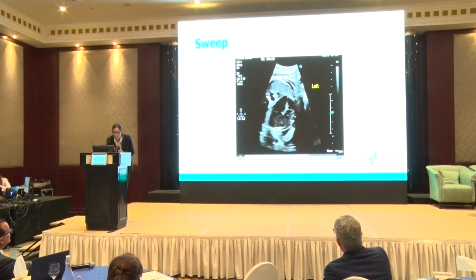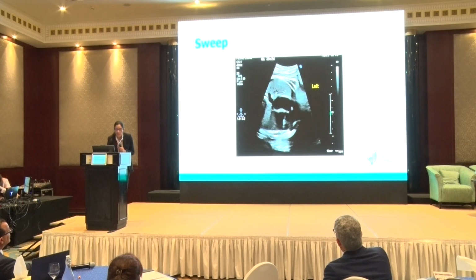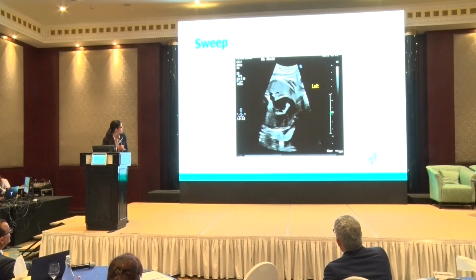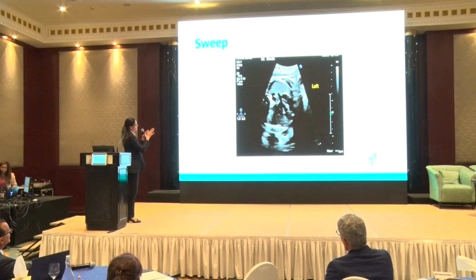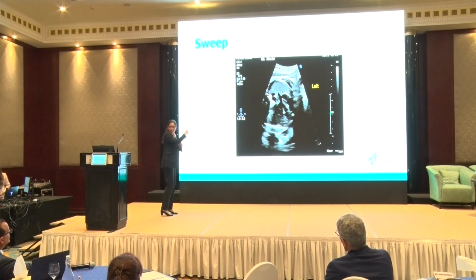But they both seem, if I'm honest, to be committed to that right ventricle that is on the left side. Yeah, so one vessel coming from this right ventricle, and then the second vessel is also coming from the right ventricle. Yeah, we all agree? And then we see the second vessel is smaller, and it's branched. So that's probably our pulmonary artery, and it's the one that is overriding the septum. So we have kind of a TGA. This is another possible Taussig-Bing. So TGA.